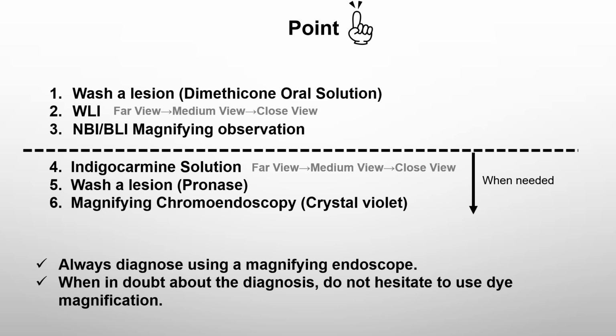Always diagnose using a magnifying endoscope. When in doubt about the diagnosis, don't hesitate to use dye magnification.